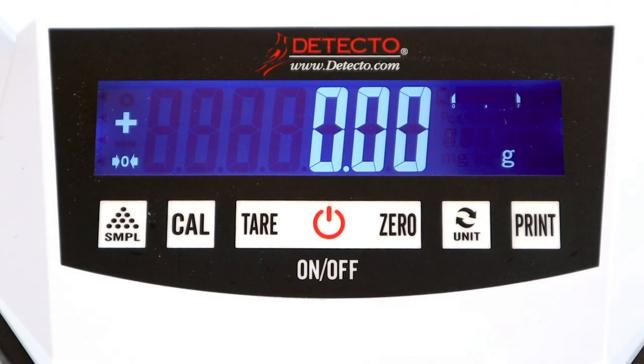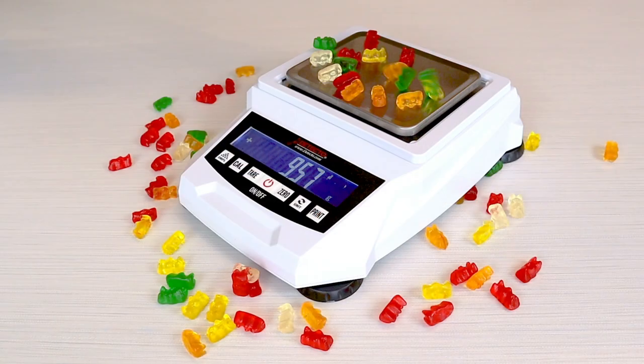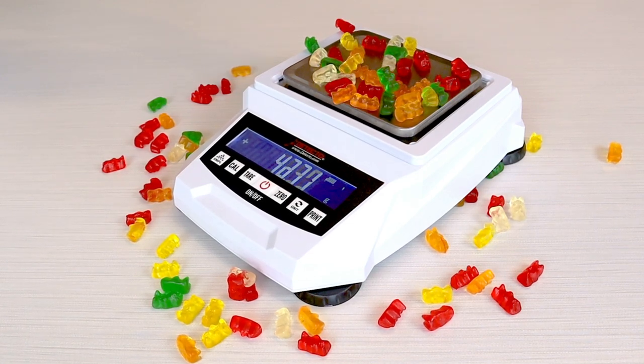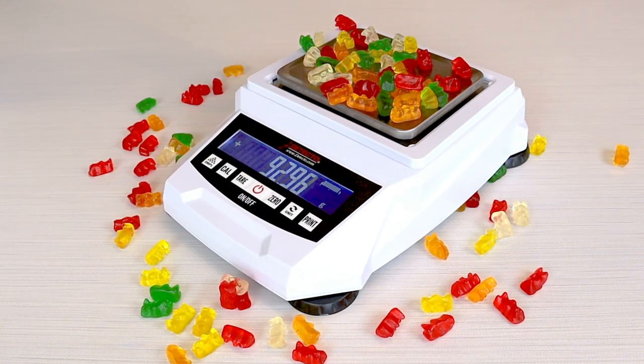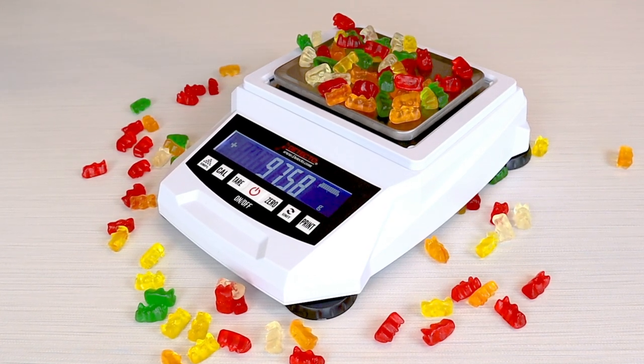The scale display has nearly 1-inch high weight digits with blue backlight for easy viewing. The backlight makes it easy for reading the weighing results from a distance or in areas where lighting is dim. The display is angled conveniently upward for easy viewing.